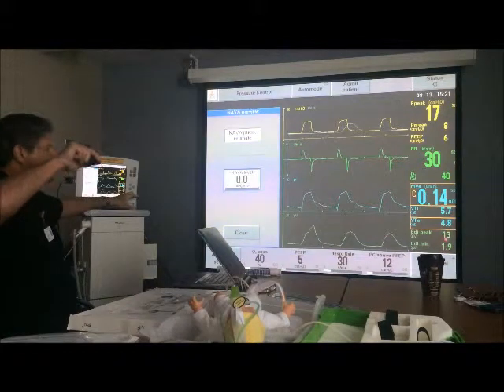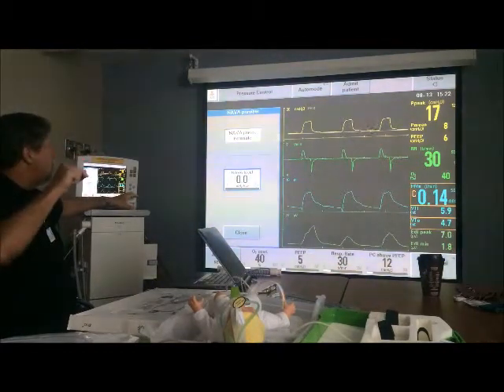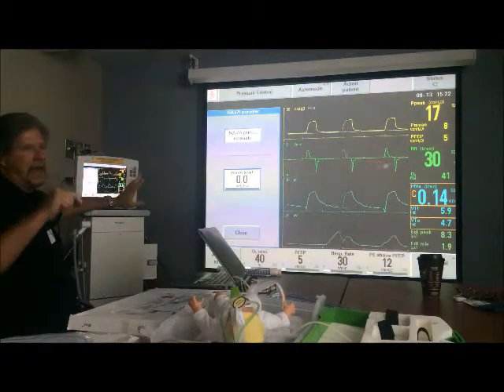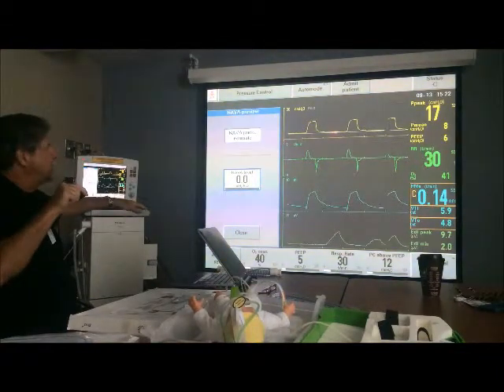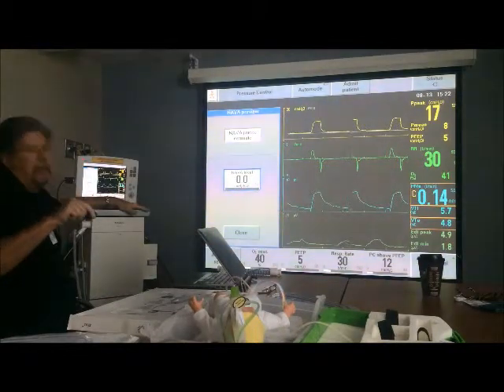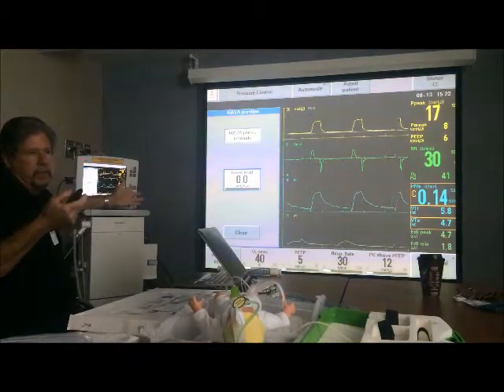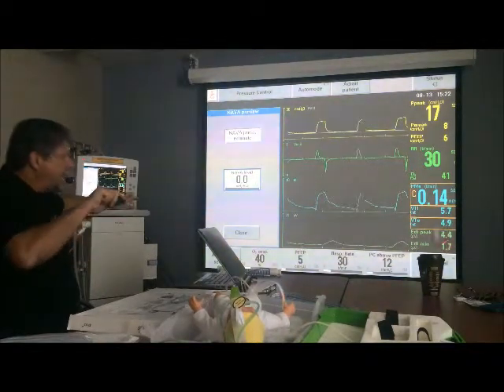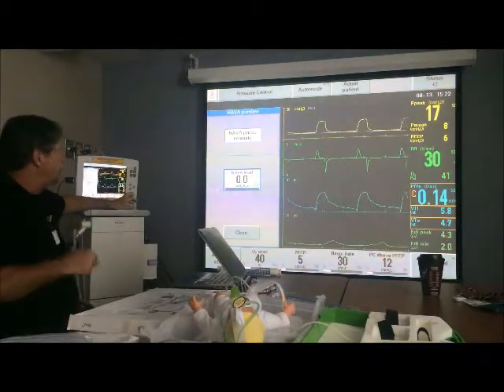0 times whatever this number is always going to be 0. So if we moved the patient to NAVA now, he would basically be on CPAP. He wouldn't be getting any support at all, because 0 times whatever his EDI is going to be 0, right? Because once again I can't do the mathematics in my head that fast, we'll let the ventilator do it.